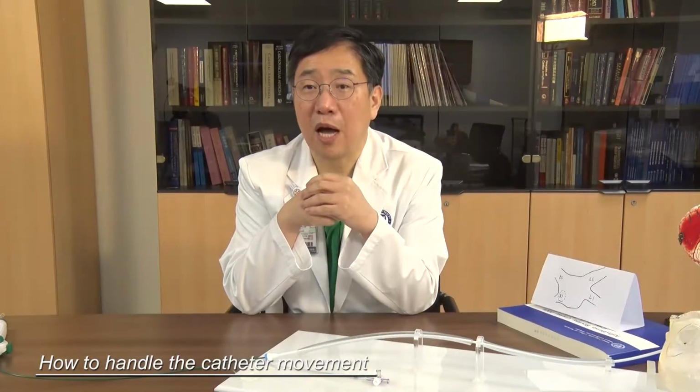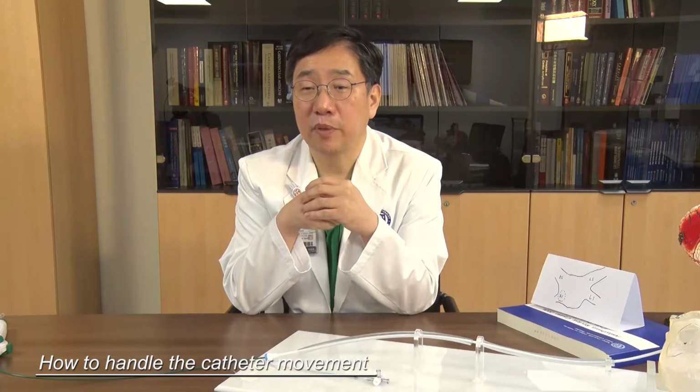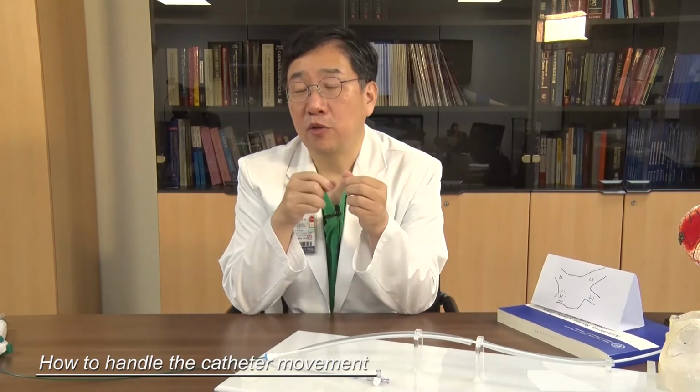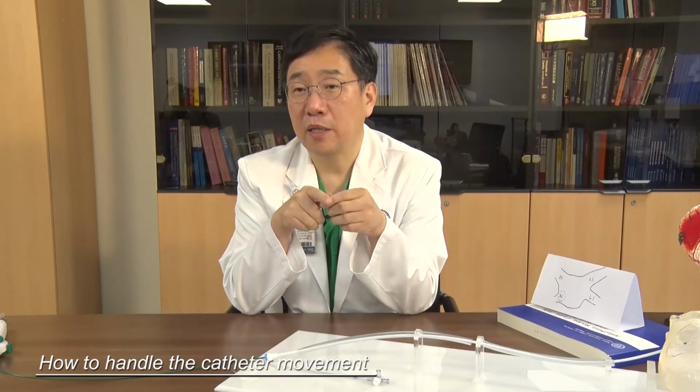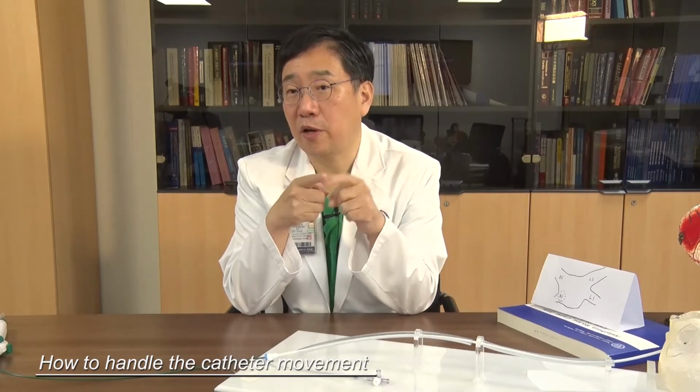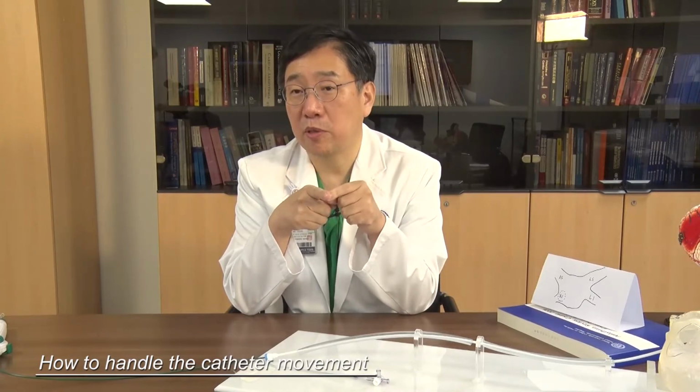Now I would like to explain how to handle the catheter movement. Rule of thumb: when you put your catheter inside the body, if the tip of the catheter doesn't move, do not push the catheter. That is very, very important for the safety of the patient.